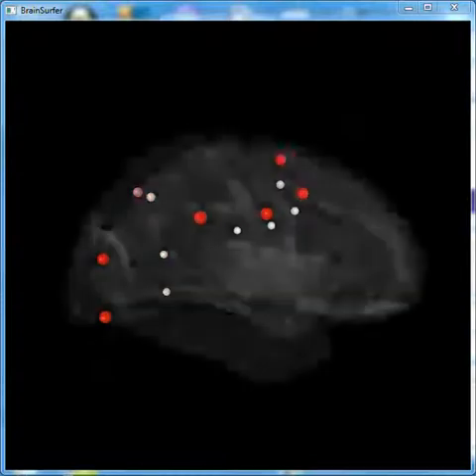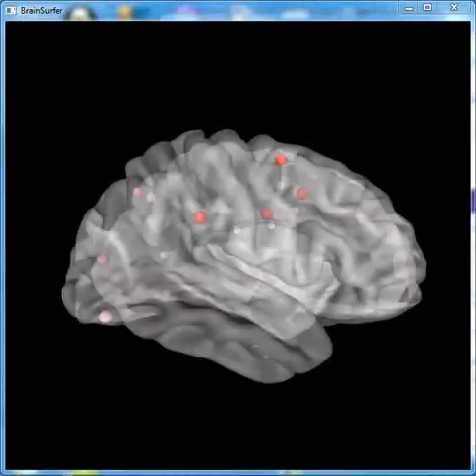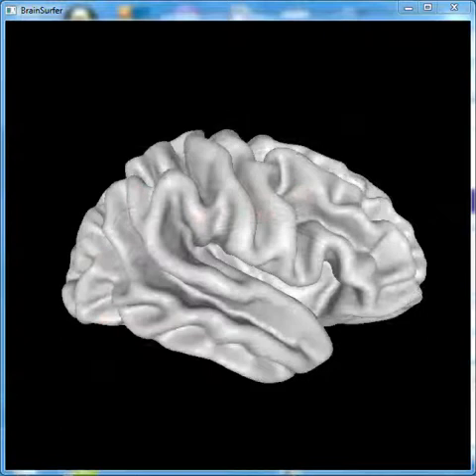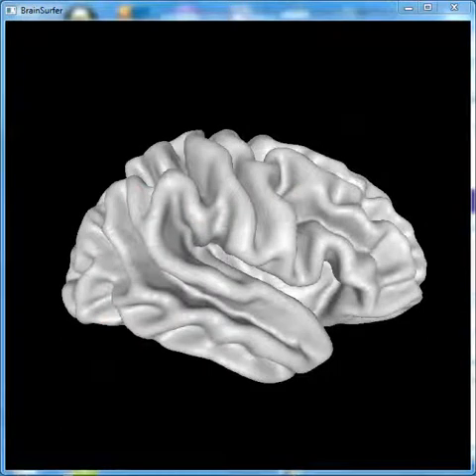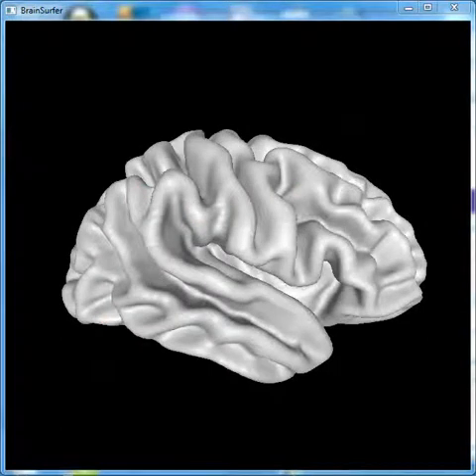We'll bring the brain back. And next, we'll look at the sLORETA coherence between nodes that comprise the dorsal attention network.